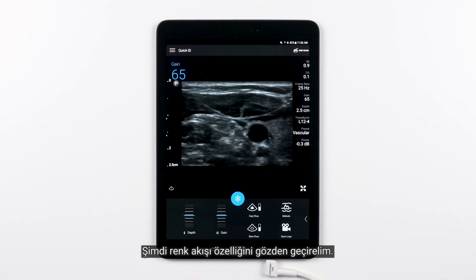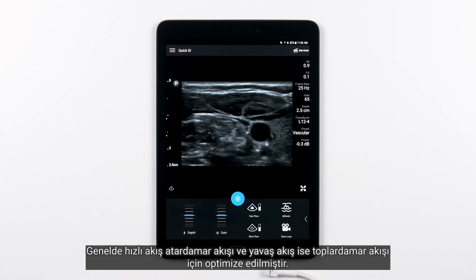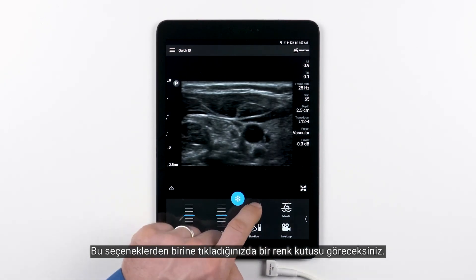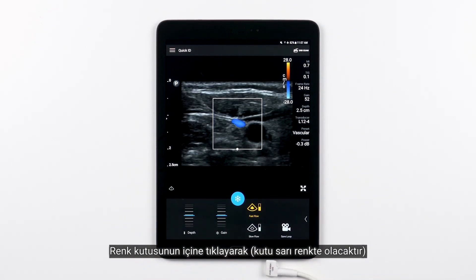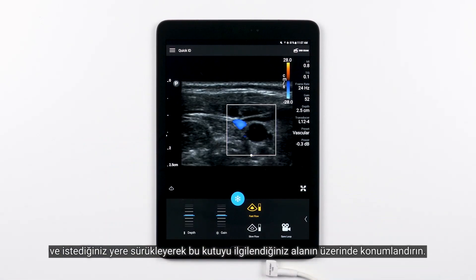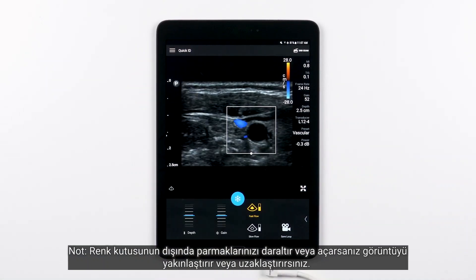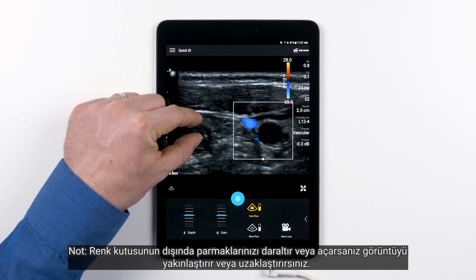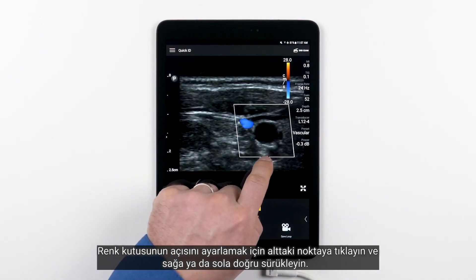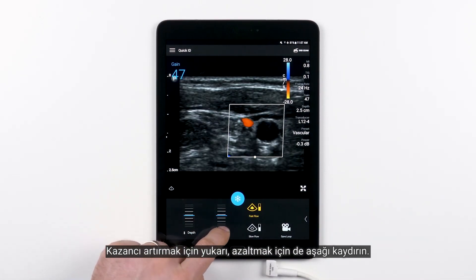Now let's review the Color Flow feature. You have two options for Color Flow: Fast Flow and Slow Flow. Generally, Fast Flow is optimized for arterial flow and Slow Flow is optimized for venous flow. When you tap one of those options, a color box will appear. Position the color box over the area of interest by touching inside the color box — the box will turn yellow — and drag it to the desired location. You can adjust the size of the color box by pinching or spreading your fingers inside the color box. Note, if you spread or pinch outside the color box, you zoom and unzoom the image. To adjust the angle of the color box, touch the dot on the bottom and drag it to the right or to the left. While you are in Color Flow, use Gain to adjust the color gain. Scroll up to increase Gain and scroll down to decrease Gain.